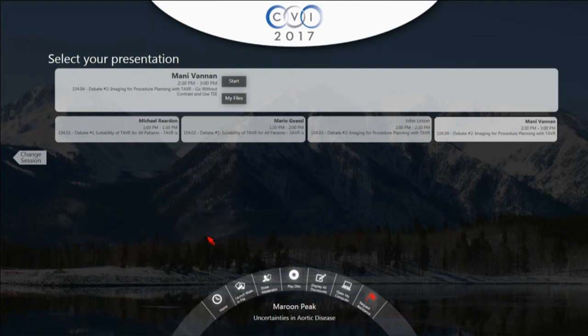Question? Hi, Dr. Vannan, great talk. I have one comment and one question. One comment I was going to make was for calcium scoring, you have to use a non-contrast CT because you use a maximum intensity projection, and if you have contrast, it's sort of an error.